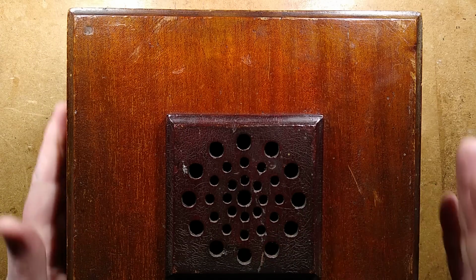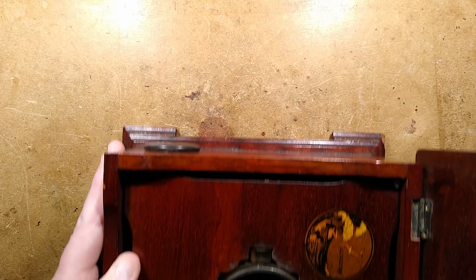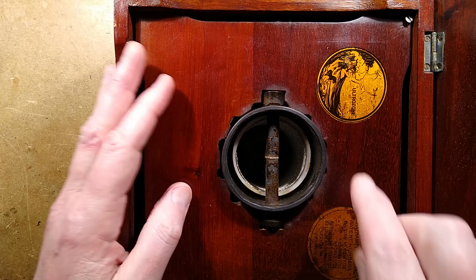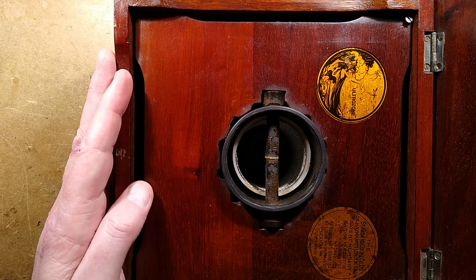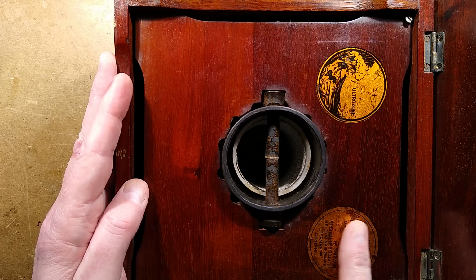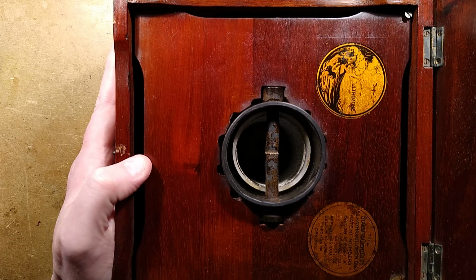Anyway, you open it up. I'm going to have to film it back for this because it is quite a big unit. It hinges open to reveal a port in the middle and these big gold stickers that say Ultrazone and Standard Ozone Co. Haymarket, and then all the patent numbers of their special secret thing.